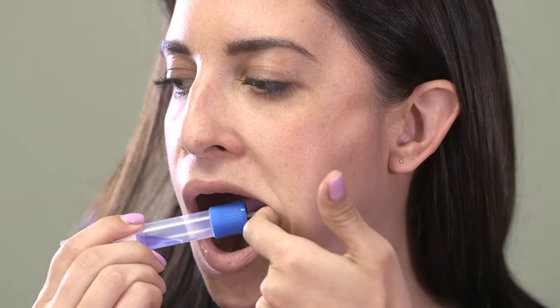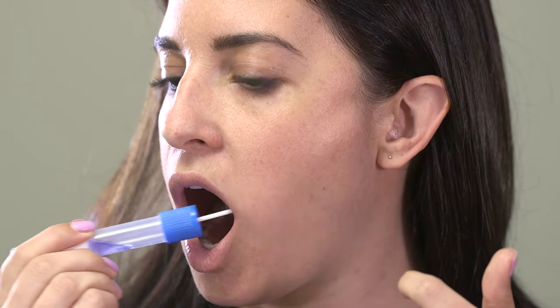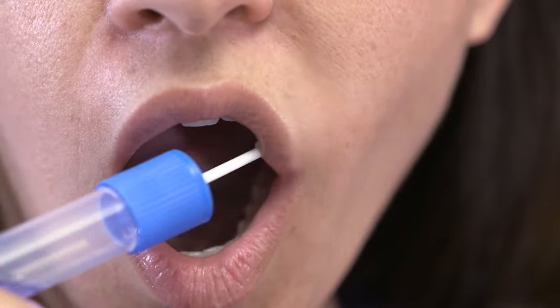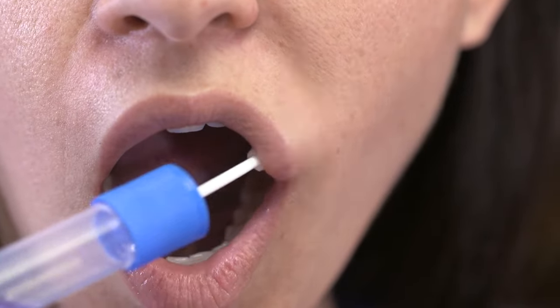Move the sponge to the middle of the inside of the left cheek. Firmly scrape the inside of the left cheek at least 10 times.